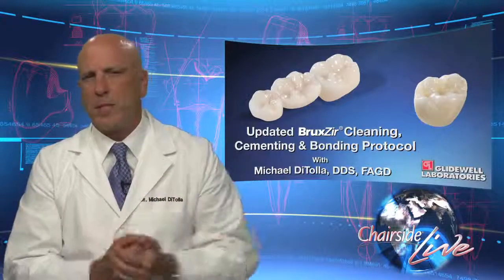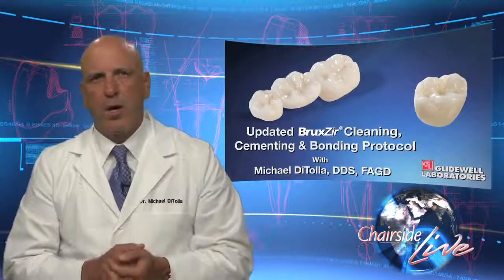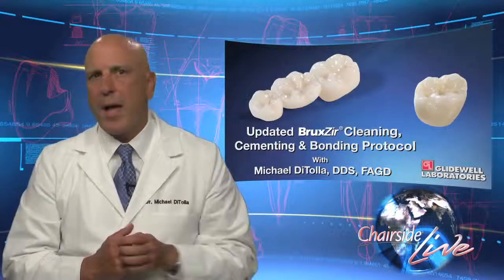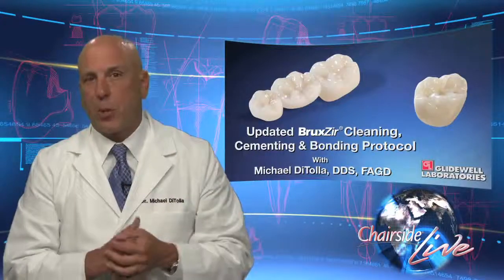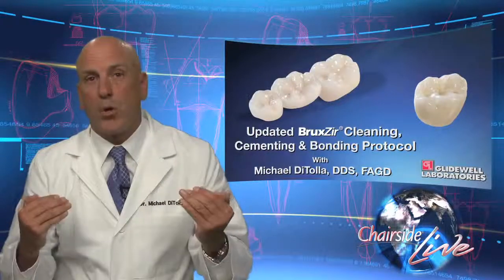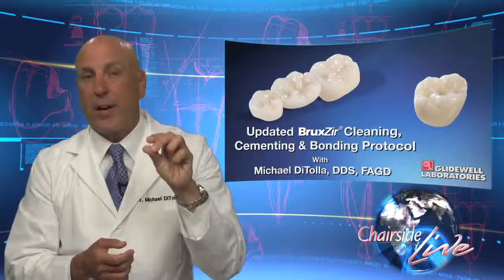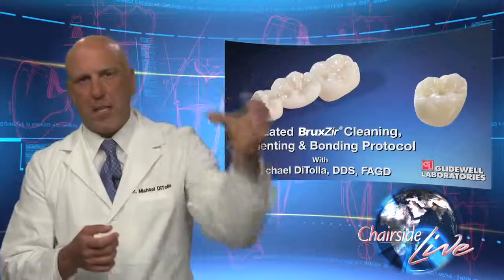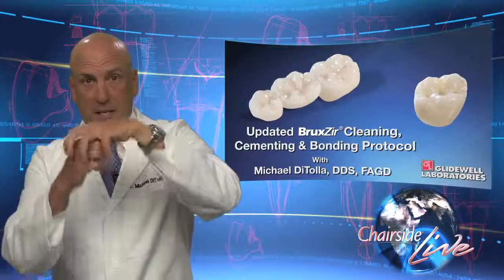Now, the reason why dentists often ask, well, why might a crown like a BruxZir crown come off more or seem to come off more than another zirconia-based crown like a lava crown? And that's a great question. And the reason why is because of BruxZir's strength as a monolithic material, we're able to use it as a cast gold replacement material. And so a lot of the restorations that we get from dentists are on lower second molars, areas where we can't get a lot of reduction. And by definition, we have a very short clinical crown, a very non-retentive situation. So when you mix that non-retentive crown prep with the fact that the BruxZir crown got tried in and contaminated and now nothing's sticking to it, that has a tendency to fall off more.